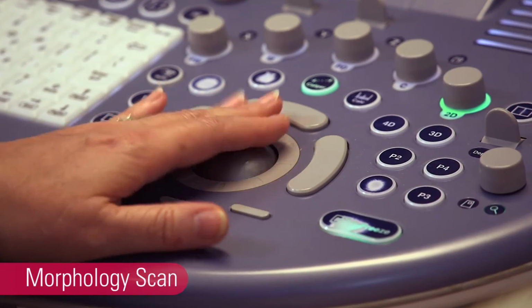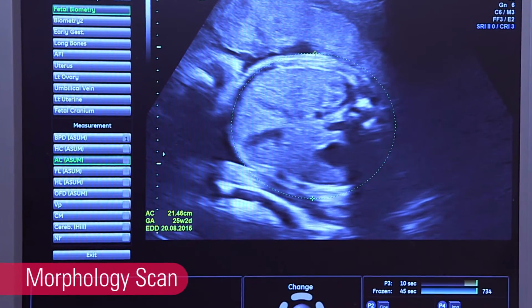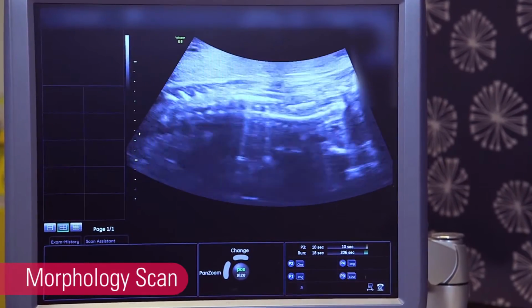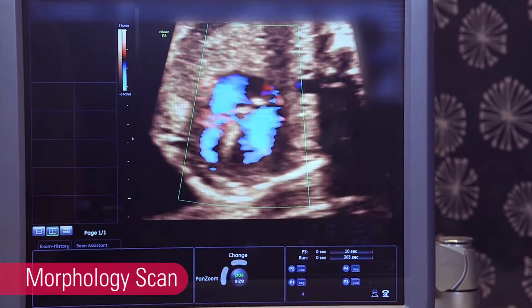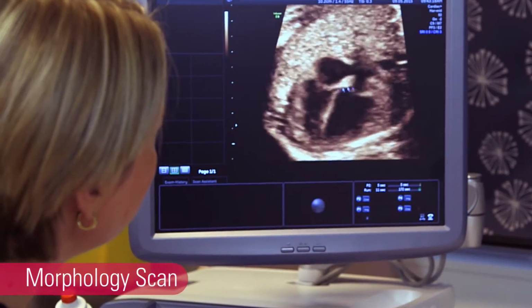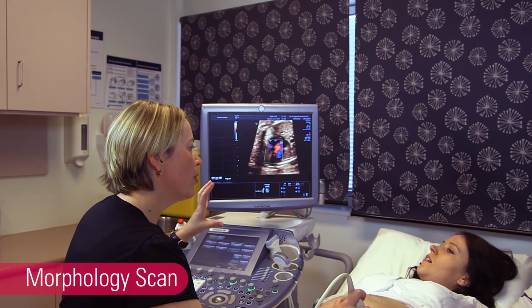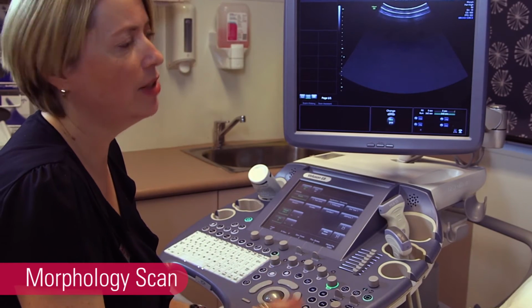During this examination, your sonographer will assess the baby, measuring the circumference and diameter of the head, the circumference of the abdomen, and the length of the femur or thigh bone. The sonographer will also look at the major structures in the baby, particularly the brain, heart, spine, kidneys, bladder, and face. Because your baby may not always be lying in the ideal position for the scan, or if your dates aren't quite right and the baby may be less than 18 weeks, we may not be able to get all the information we'd like. If this occurs, we may suggest you come back for another scan at a later date.